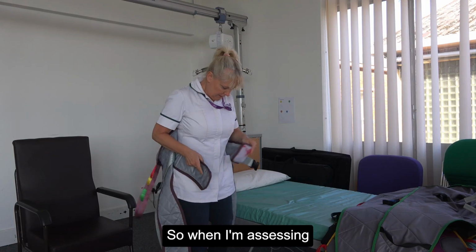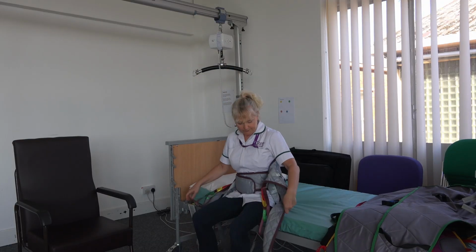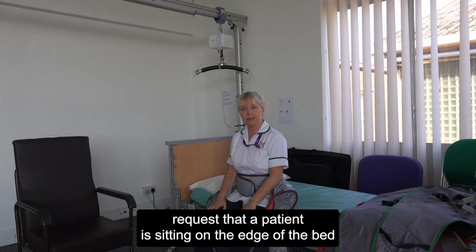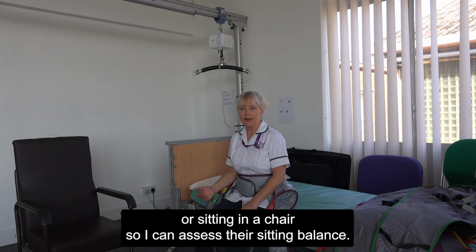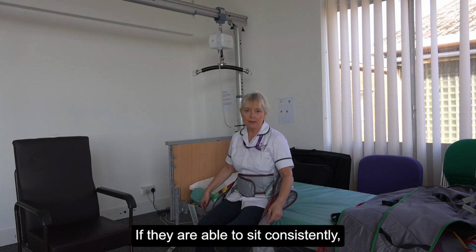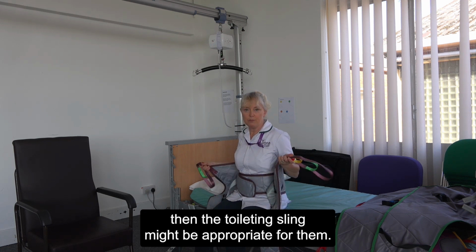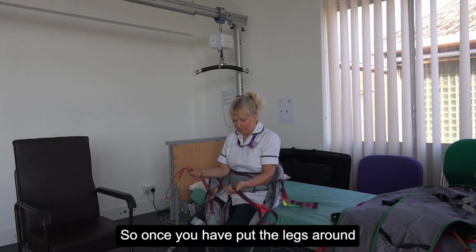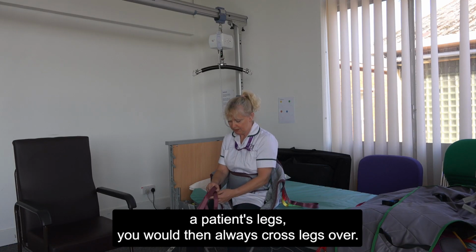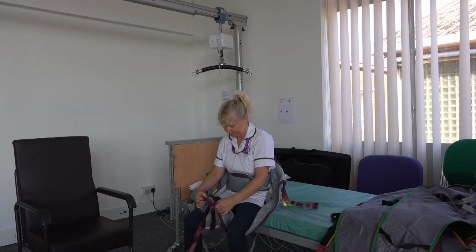When I'm assessing for this type of sling, I would always request that a patient is sitting on the edge of the bed or sitting in a chair so I can assess their sitting balance. I would be looking for good, consistent sitting balance. If they are able to sit consistently, then the toileting sling might be appropriate for them. Once you have put the legs around a patient's legs, you would then always cross the legs over. You would be doing this with every different type of sling that you use.